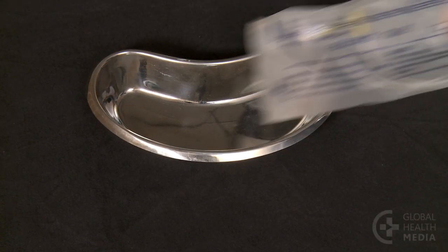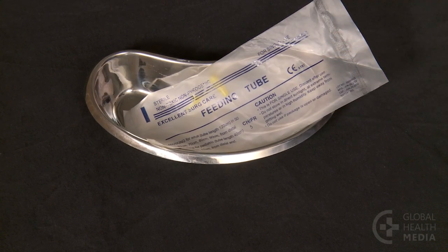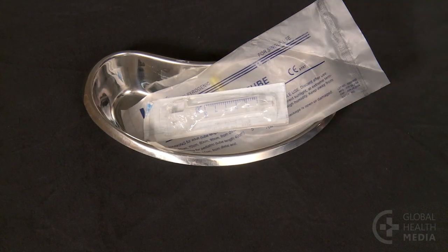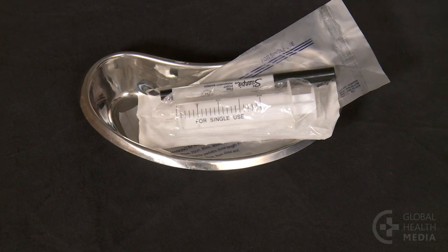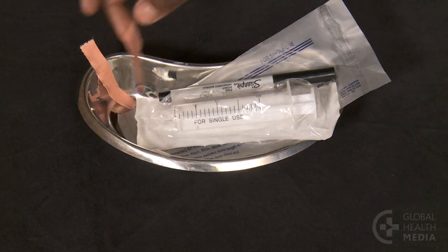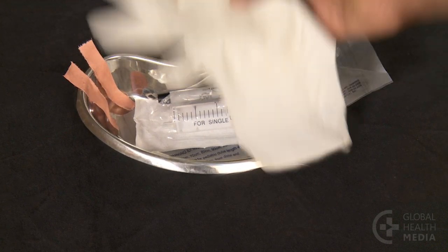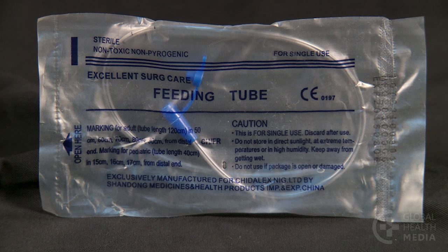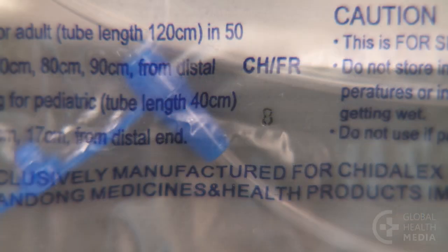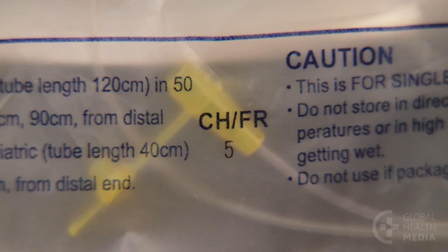To start, gather the gastric tube, a 5 ml syringe, a feeding syringe, a marker, and tape. Gloves are optional. An 8 French gastric tube is a good size for a normal newborn, and a 5 French is best for a small baby.